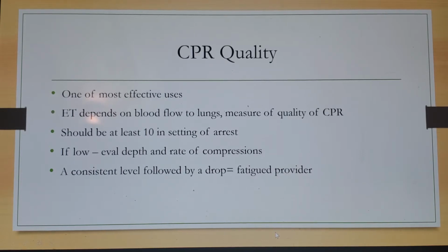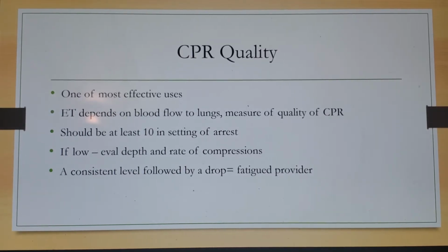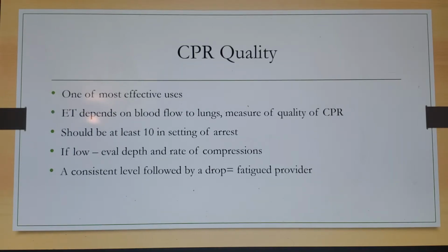This is one of my favorite uses for end-tidal CO2, basically in your full arrest. With the advent of bedside echo in the ER and end-tidal CO2, once you get to a destination, I really don't see a need for pulse checks anymore. But we'll get to that. One of the things it shows is your CPR quality. End-tidal, like we said, depends on blood flow to the lungs. Well, a return of blood flow to the lungs is one of the best measurements of quality of CPR. If you're giving good, solid compressions, you should be able to get an end-tidal CO2 of at least 10.